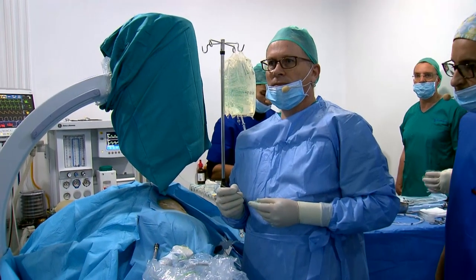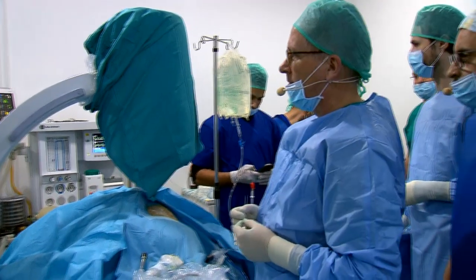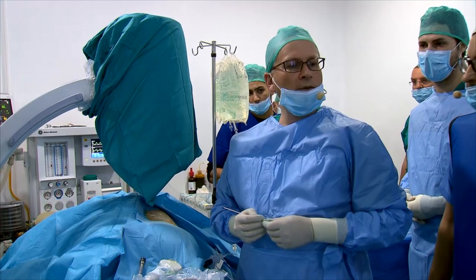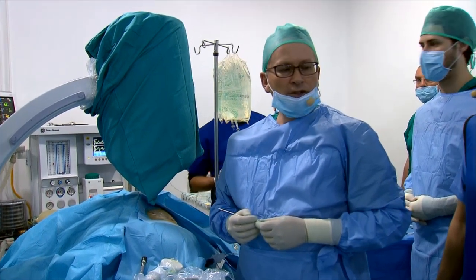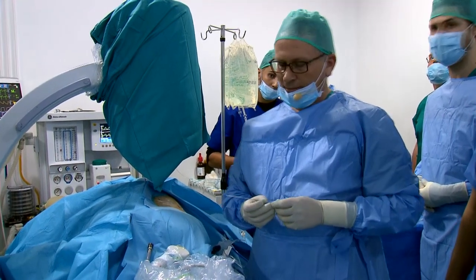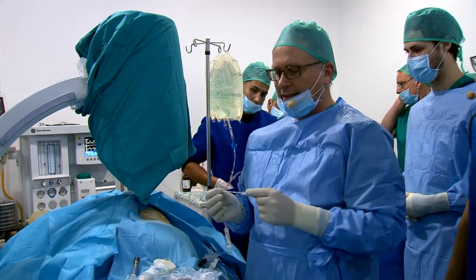Now what? We see clearly that both stones are on the same calyx, and we can access them with one access. Yes, you are right. I'm not 100% sure, but my suggestion is that we do only one puncture. Okay? Now let me explain the procedure, and we can discuss all the things later on.